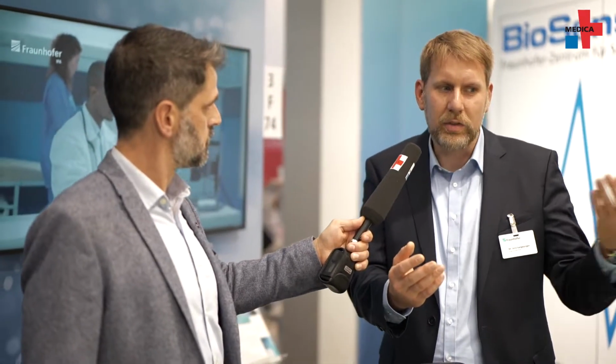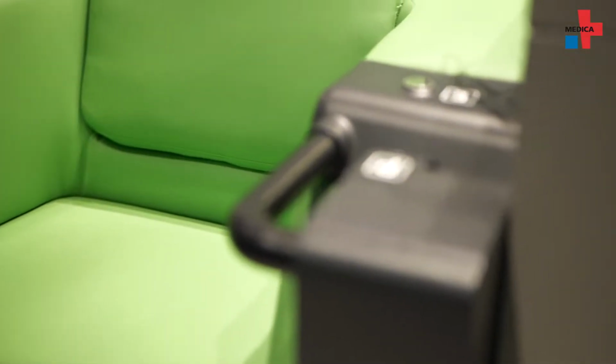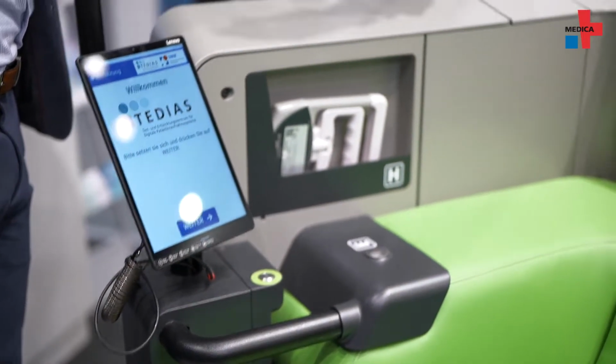Exactly. We identified there are a lot of digital solutions, let's say a digital questionnaire, but in the end, these solutions are not very often really integrated into the whole workflow. So you have to either print it out or copy and paste it somewhere. We said we want to integrate everything in one process. So we built this test bed, which is a chair with sensors for vital parameters like blood pressure, ECG, respiratory parameters, oxygen saturation, also a balance integrated into this. All the information that's collected here is directly merged and then sent to the clinician, and also sent to the clinic information system so it can be directly used.